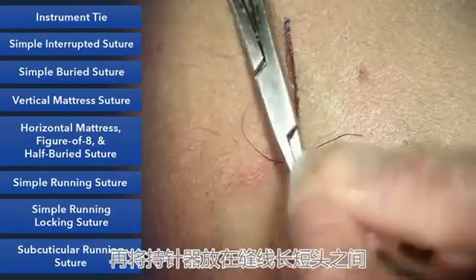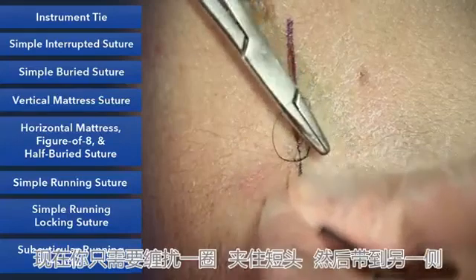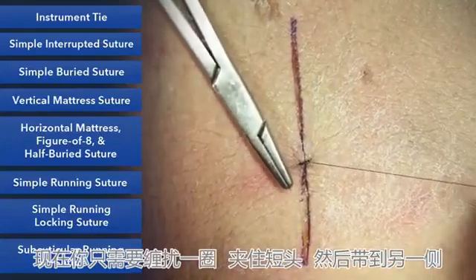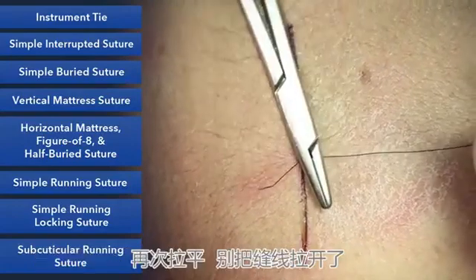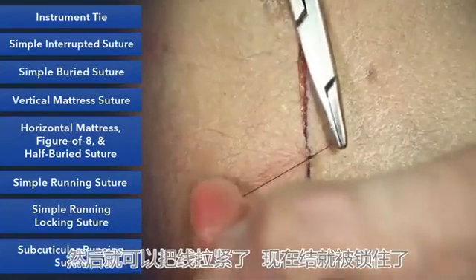Place the needle driver between the two, the short end and the loop end. Now you're going to loop it around only once. Grab the short end and then bring it to the opposite side. Again, squaring the knot. And don't pull up on the suture until you just get it down, and then you can tighten it. And now it's locked in place.